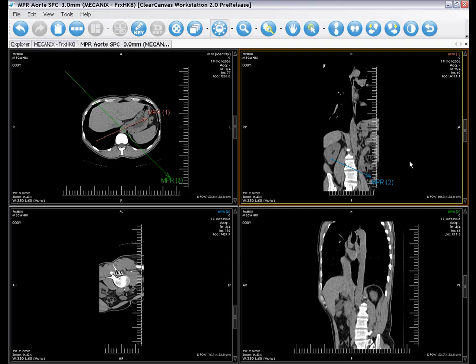MPR images can be used just like regular images, allowing you to create measurements, apply reference lines, and use any of the other tools. That's how easy it is to use MPR with ClearCanvas workstation.